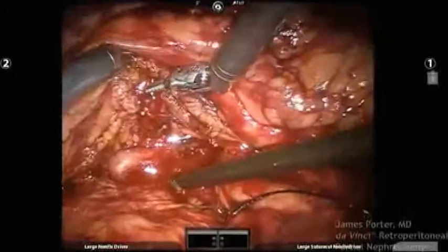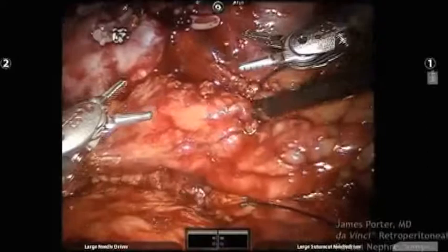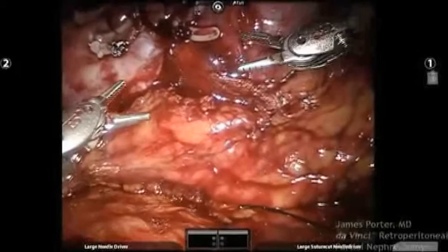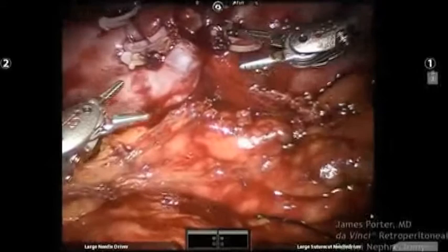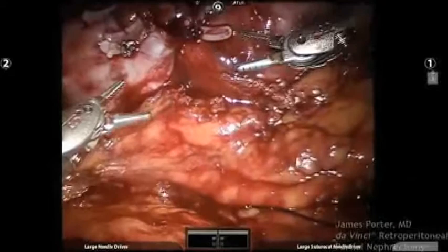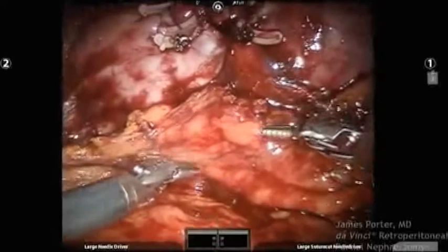And that's where your assistant is crucial to be able to talk appropriately for you in those situations. I think if you're using bulldogs, more often than not, you miss either the main renal artery or there's another artery that you didn't see on the imaging. And in that case, if it's arterial, if you've got the vein clamped and you've got one artery unclamped, it could turn into a bloody mess. I would actually stop and go look for that other vessel. But if it's venous, I think you can just keep working through it.